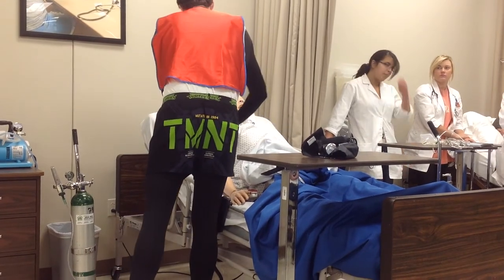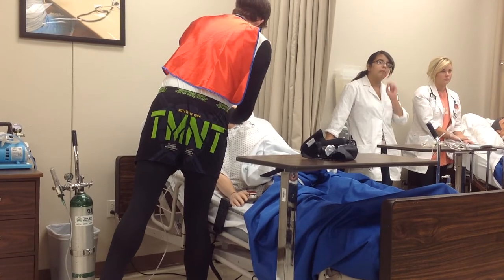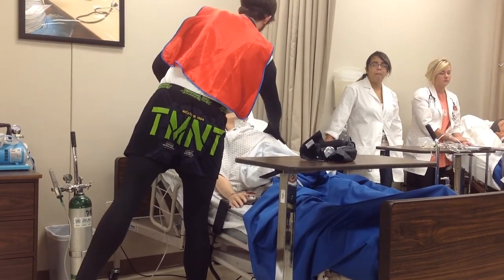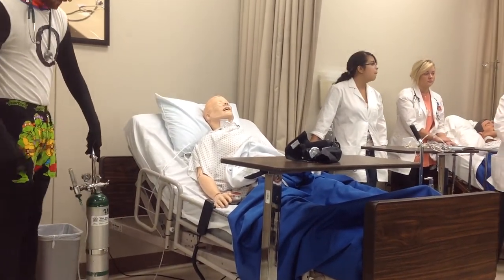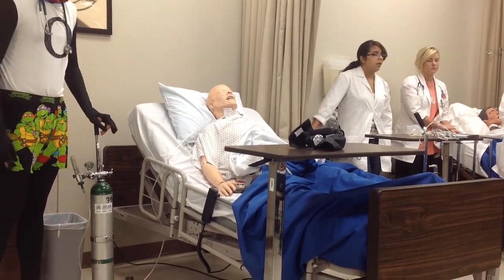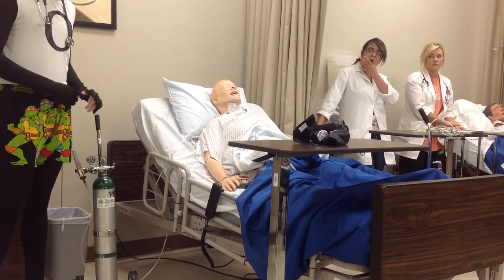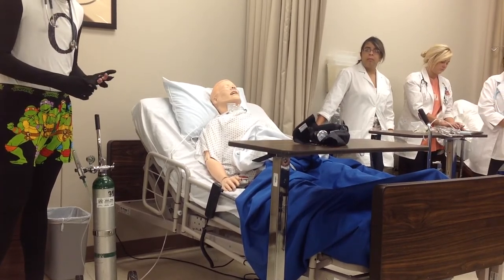you'll need to come back and check every 2 hours to make sure that the oxygen tank has air in it. Make sure it's still on the dosage that you're supposed to have it on. Also, at this time, you can check the skin integrity around the face. Sometimes, like Saul said, the nose can be dried out by the nasal cannula. So what you want to use is a lubricant, but you want to use a water base instead of an oil base, because an oil base would be flammable and you don't want them catching on fire.